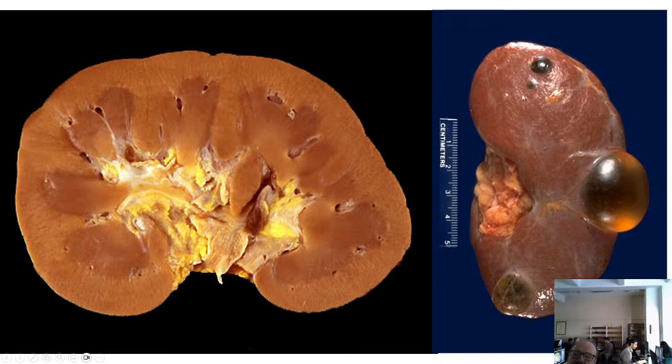And here we have a normal kidney with these simple cysts, which are of no clinical significance unless they reach a very big size, and in some sort of trauma they may rupture. However, they do not affect the renal function, and it is a very common finding in adults. There is some sort of interest as concerns their differential diagnosis with cystically structured neoplasms.